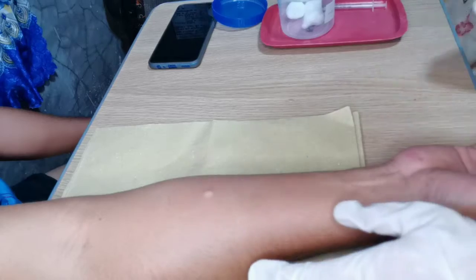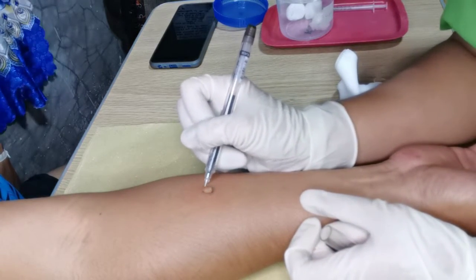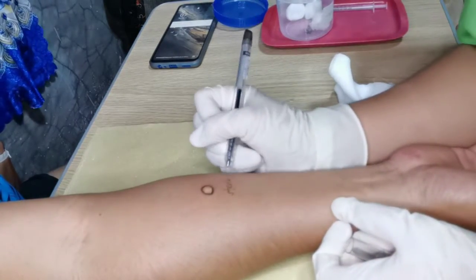Do not massage the area after removing the needle. Tell the patient not to rub or scratch it. If necessary, gently blot the site with a dry gauze square. Do not apply pressure or rub the site.